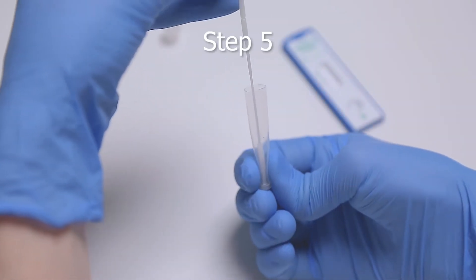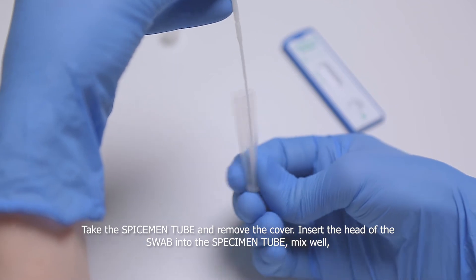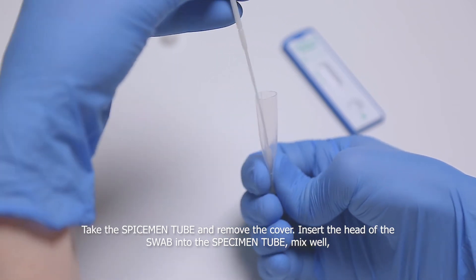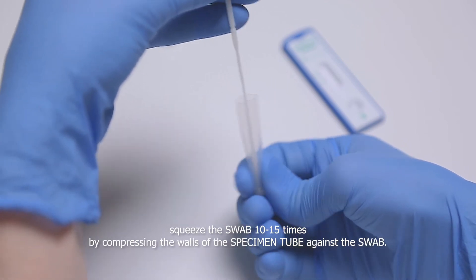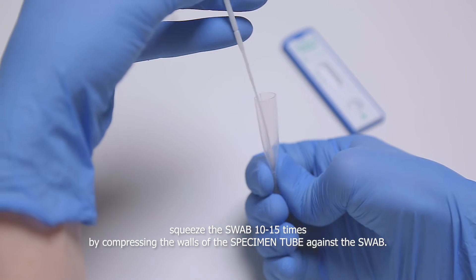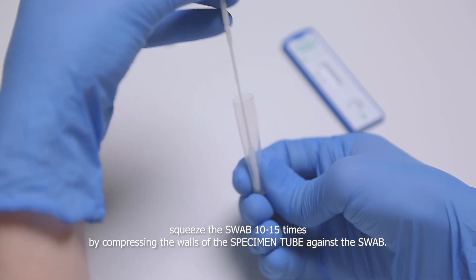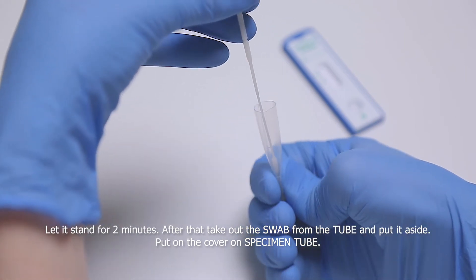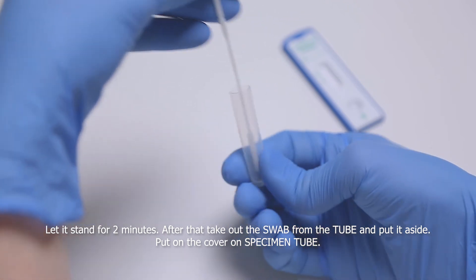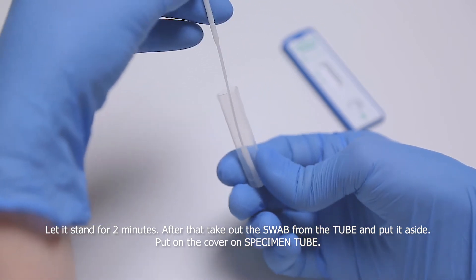Step 5. Take the specimen tube and remove the cover. Insert the head of the swab into the specimen tube. Mix well. Squeeze the swab from 10 to 15 times by compressing the walls of the specimen tube against the swab. Let it stand for two minutes. After that, take out the swab from the tube and put it aside. Put on the cover on the specimen tube.